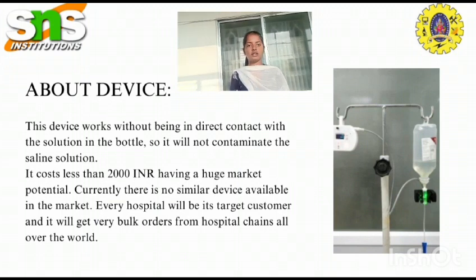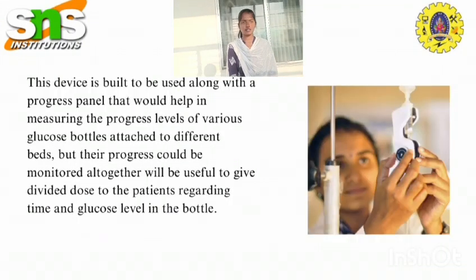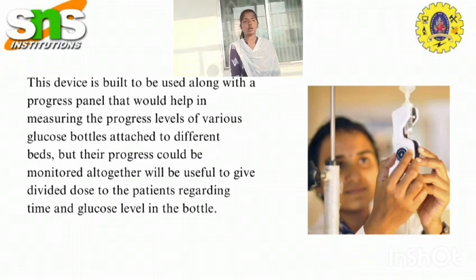The receiver or monitor is an interface through which users interact with the glucose monitoring system. It displays historical data and trends, providing users with valuable insight into their glucose control over time. In addition to the sensor, transmitter and receiver, a glucose monitoring system may also integrate with smartphone apps or other software platforms.